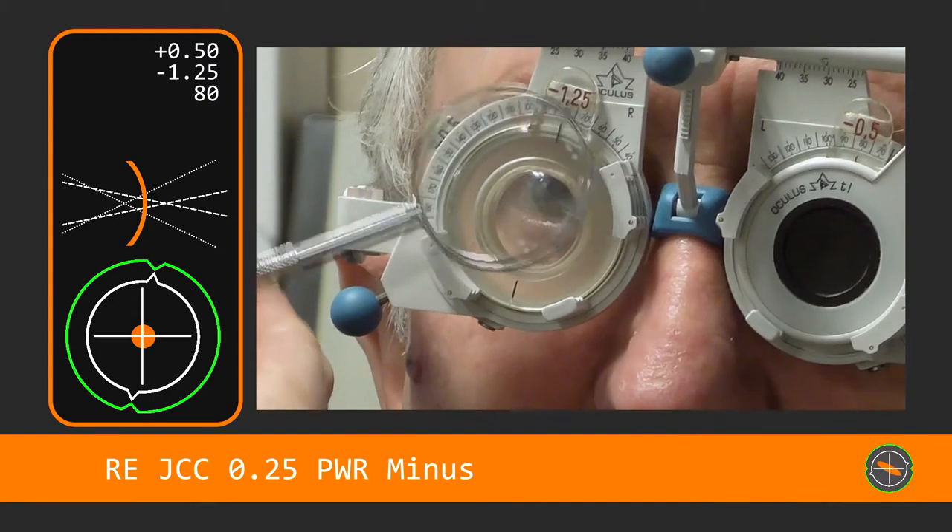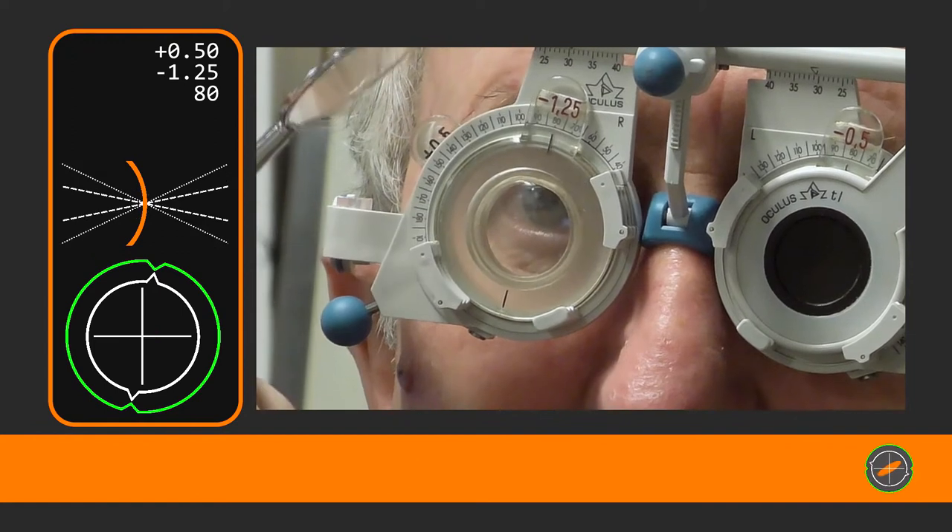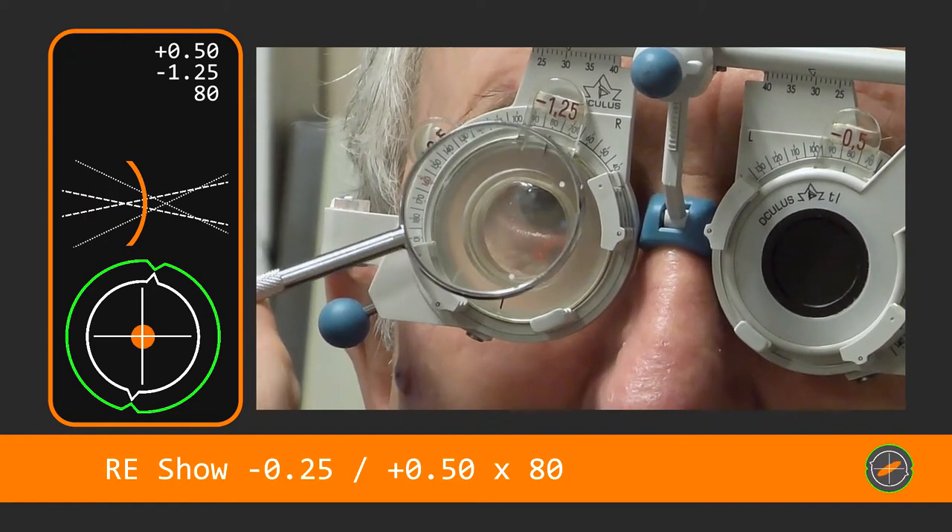Clearer was the first or the second? Second. Or if I just took it out? Yeah, that was in. In.